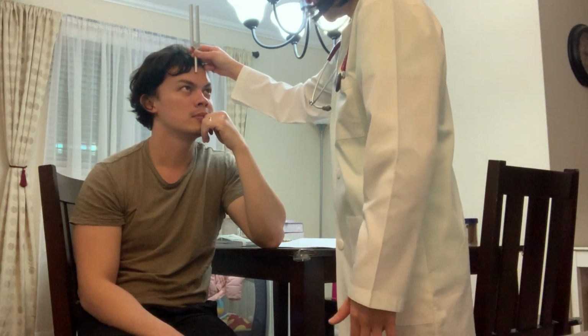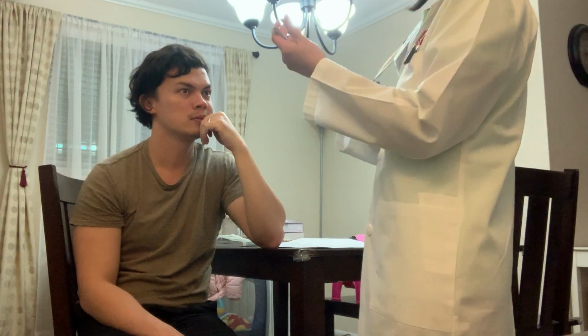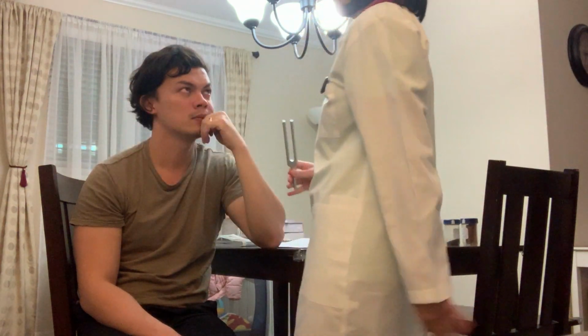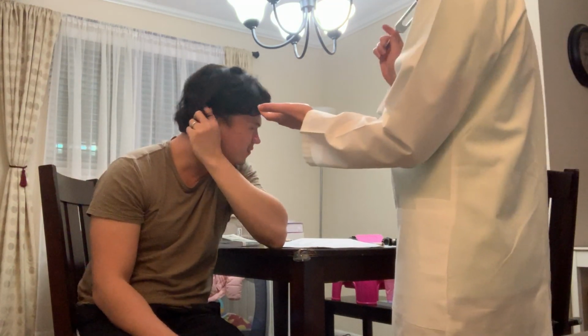Can you hear it? No. Well, I think this is a little difficult, but when I put it here, the patient should be able to hear it laterally equally. And then for the Rinne test, same thing, you're using our tuning fork.